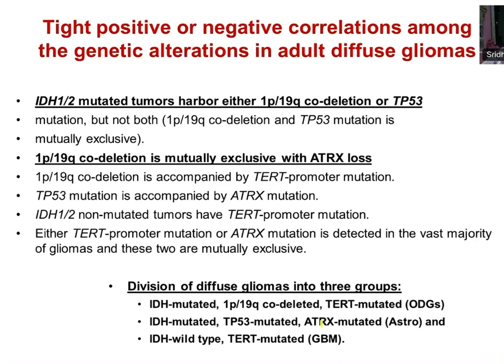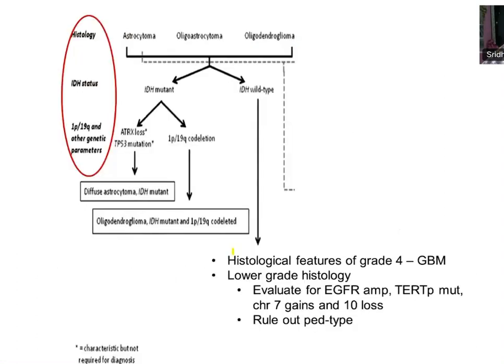astrocytic. Based on this first case, you can see that's a classic example. We can say that it's an astrocytic tumor. Only in other cases, when required, you can do 1p19 co-deletion. This is a flowchart we can use when you have an ambiguous morphology like astrocytic or oligo and all. First do an IDH immunohistochemistry.